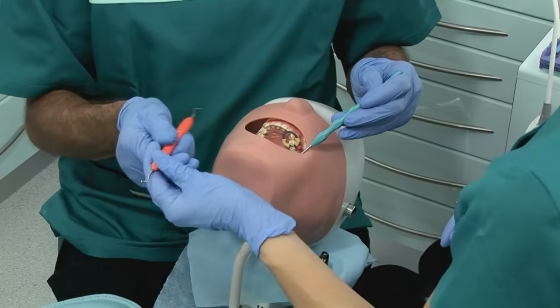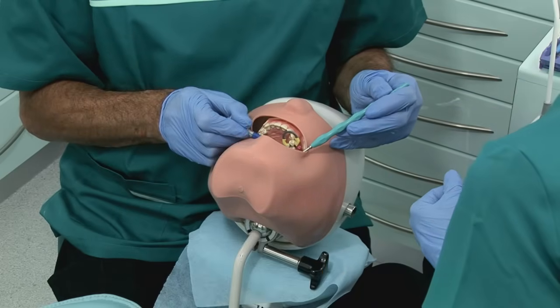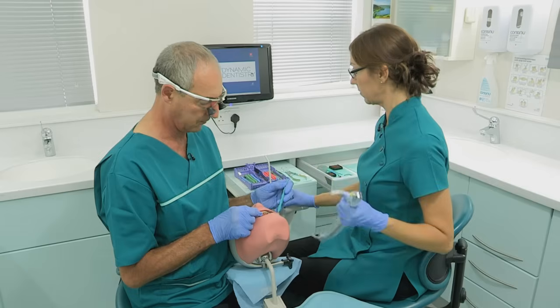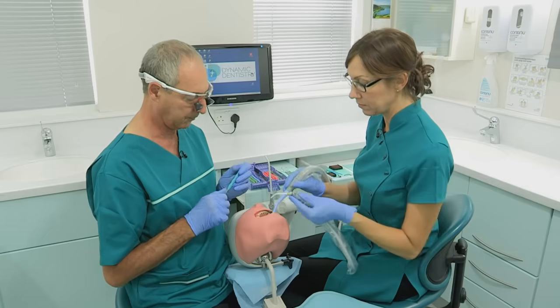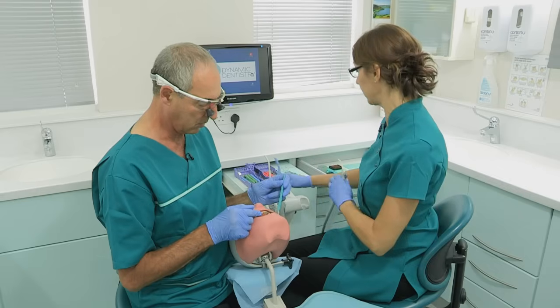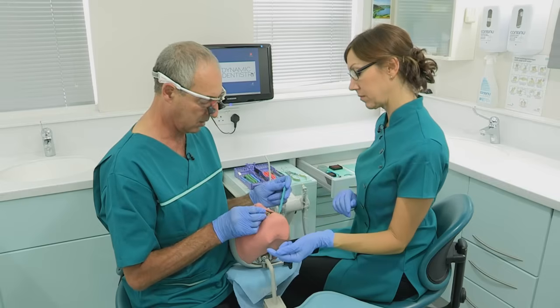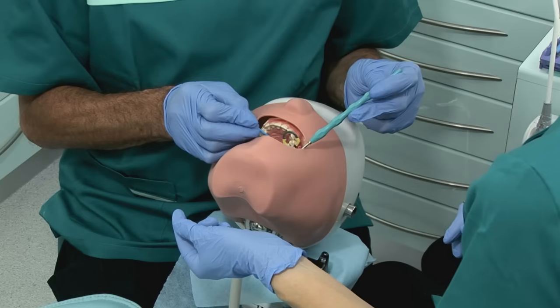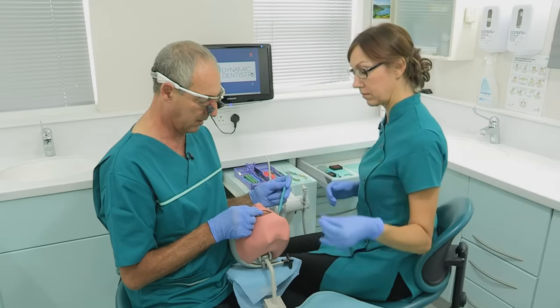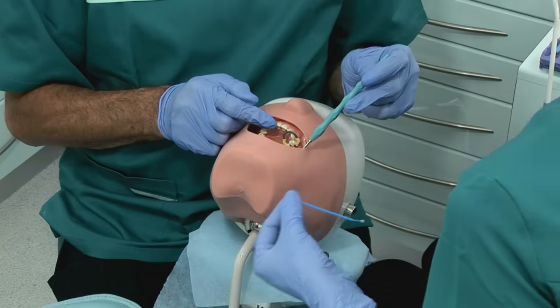so I can just concentrate on getting the band into the right shape. So now, depending on what system you use, but we'll just demonstrate using etch, prime and bond. So we might etch the tooth. We'll do a pretend here because this is a video. This obviously would have to be washed off and dried after the appropriate timing. Then I might put my primer on. But you'll notice that I'm actually not moving my head at all. Everything's being passed to me and I'm just looking at the cavity and keeping my eye exactly where I want to for operating. So we'll dry that, just evaporate that off. Sal, please, for me. Thank you. And then we'll put our bond on.